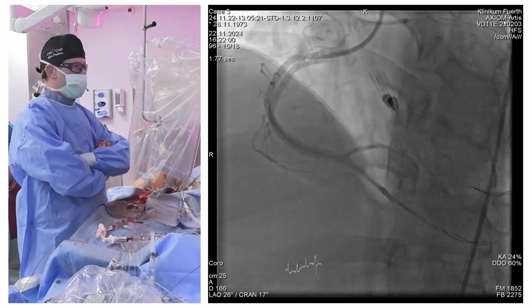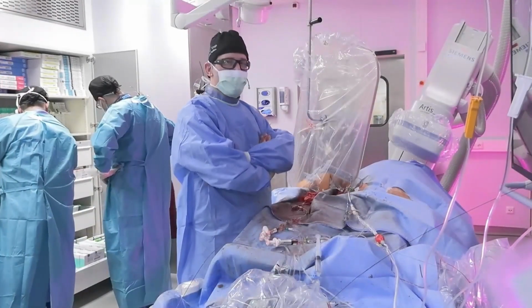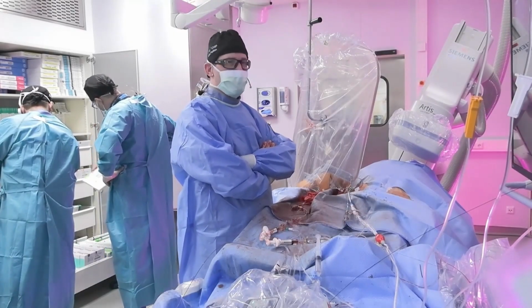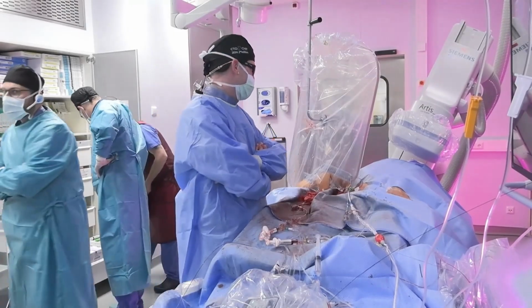Yeah, please don't stent too much in an RCA. It might give you a hard time opening it again. So DCB a lot, or use a scaffold maybe. Don't use so many stents there. Yeah, I agree with you with that.